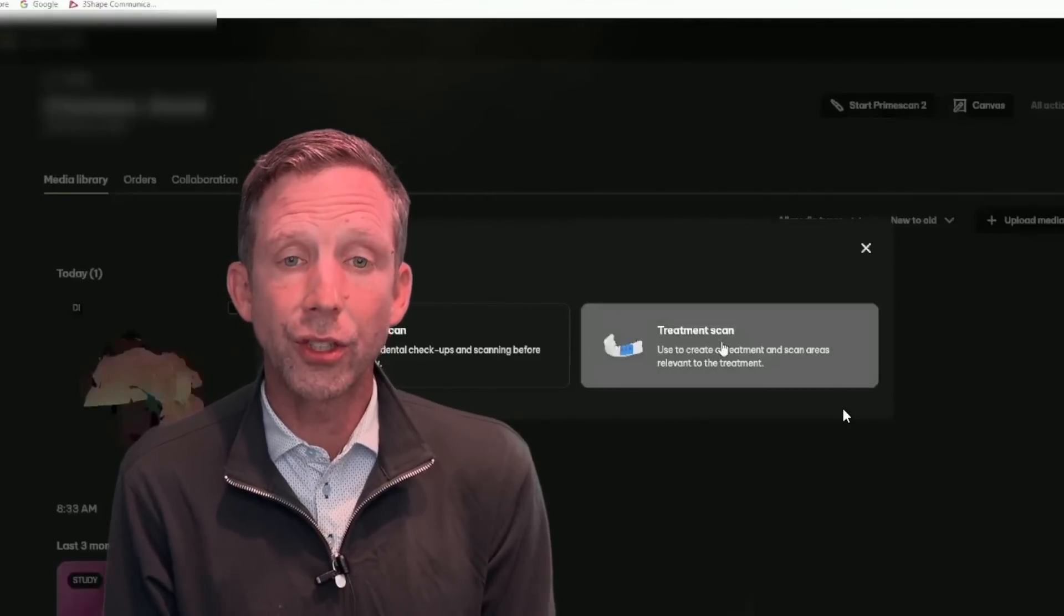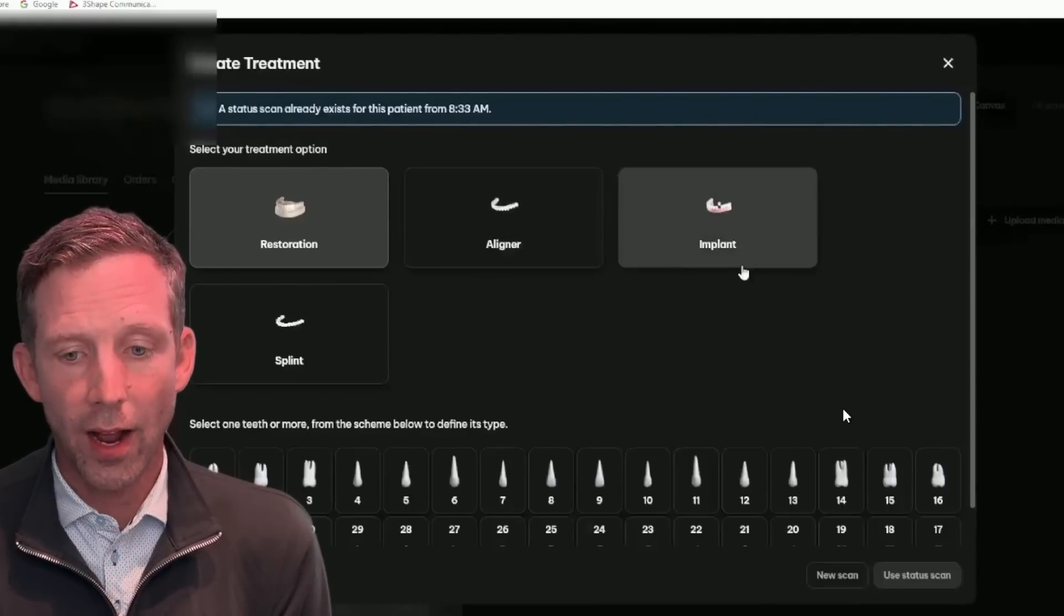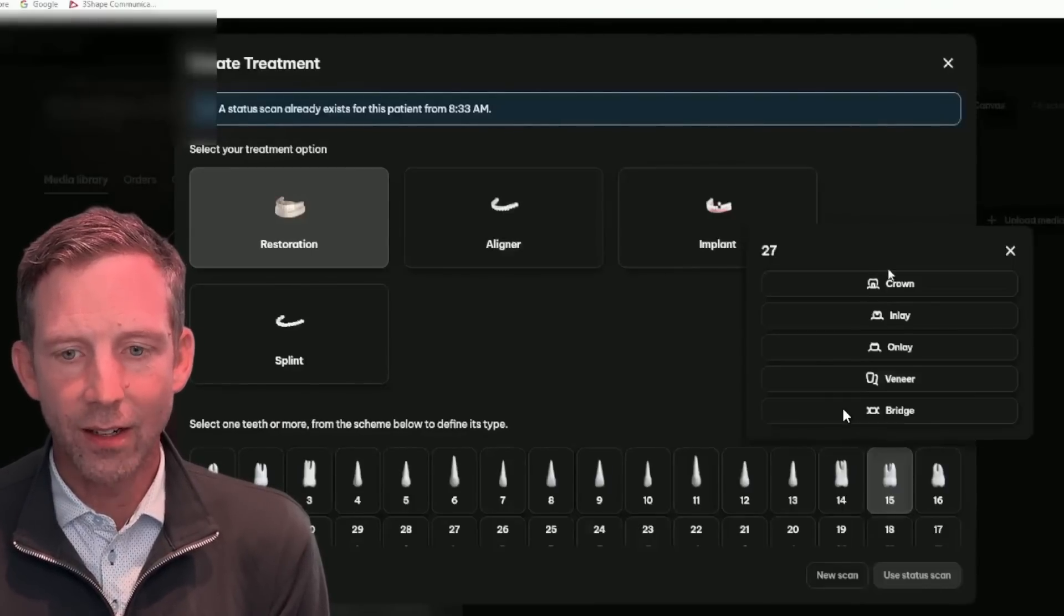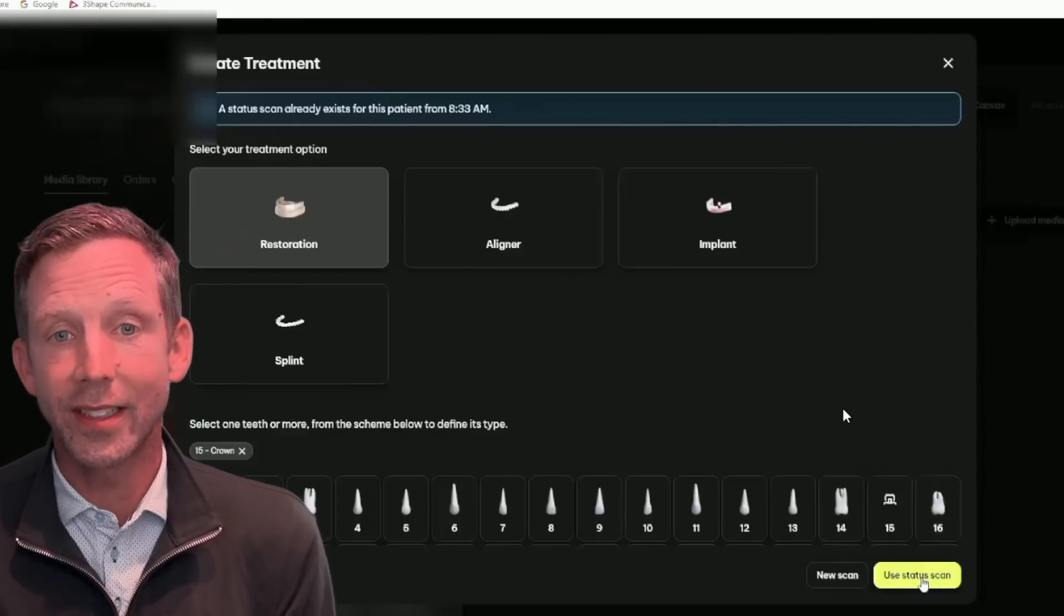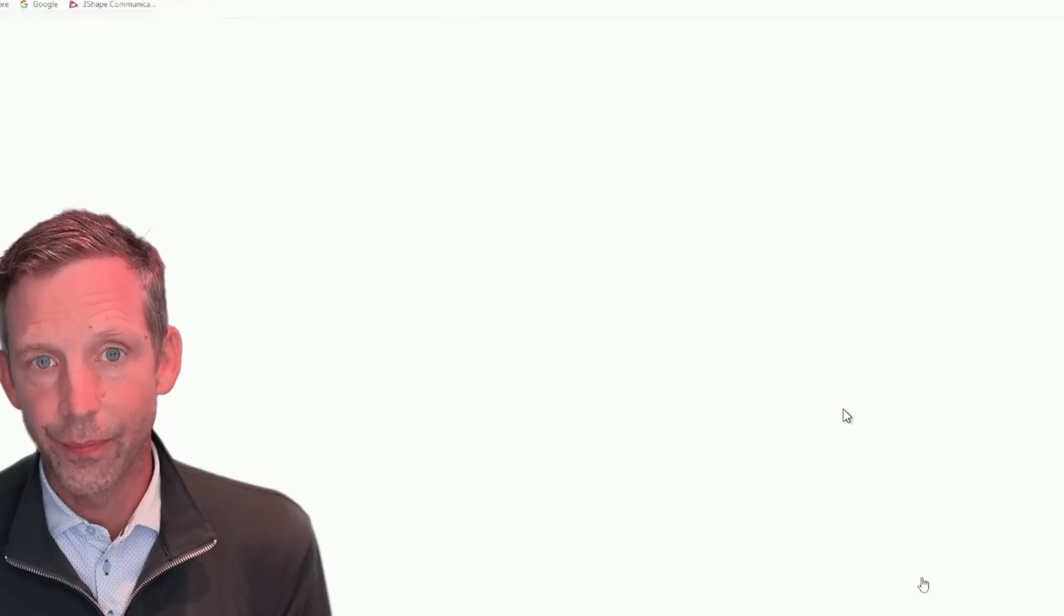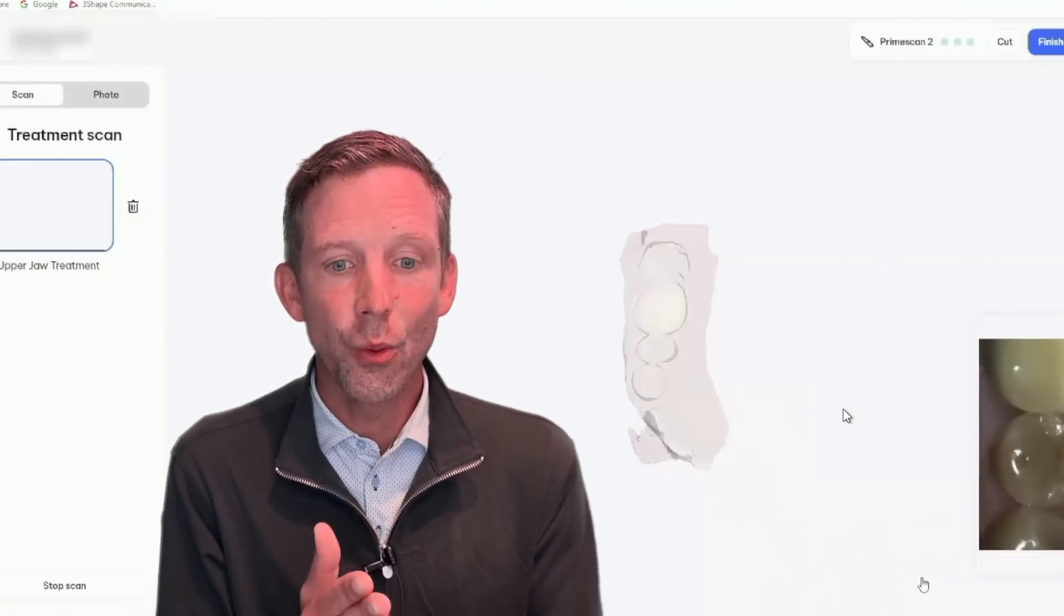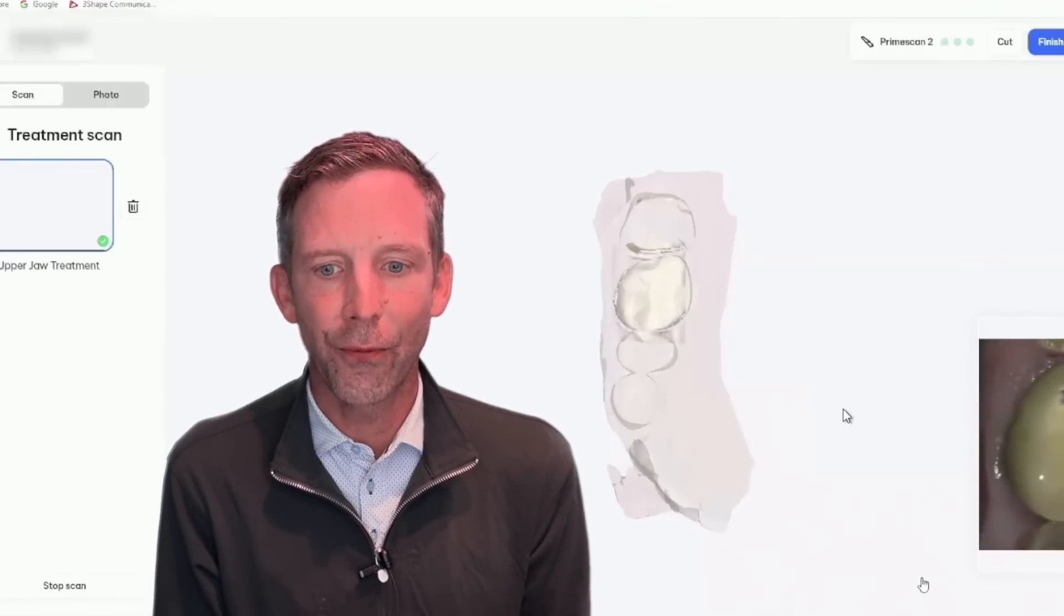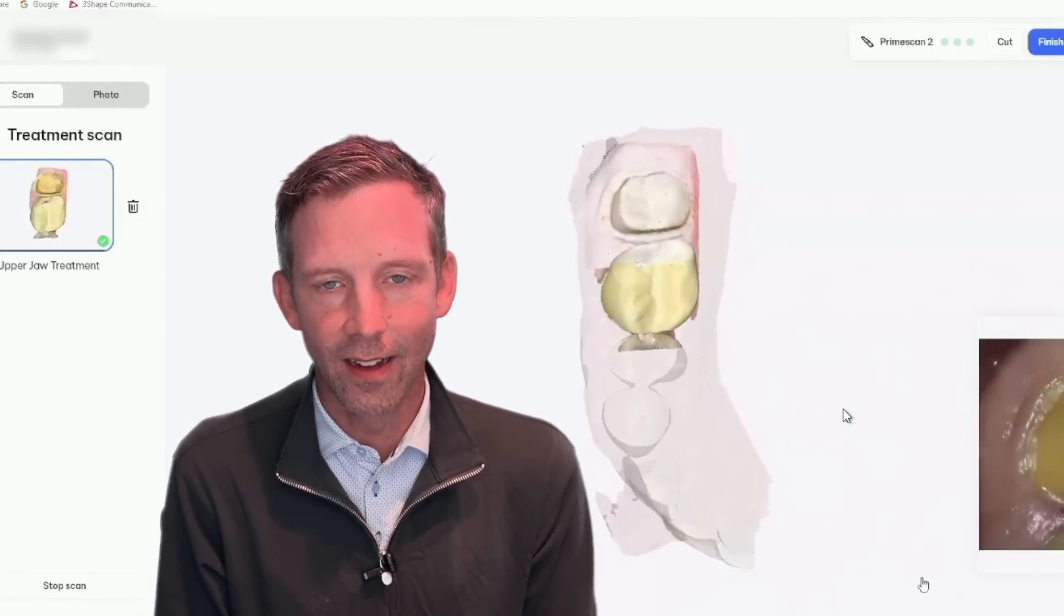So now we're going to choose treatment scan. Now, what do we want to do for treatment? Well, we're going to do a crown on tooth number 15. So it's tooth 15, we'll select crown. Do you want a new scan or use your status scan? Well, let's use our status scan. So now we don't have to use the cut tool. We don't have to do anything. We just bring it up and watch how the prep fills directly into our status scan.